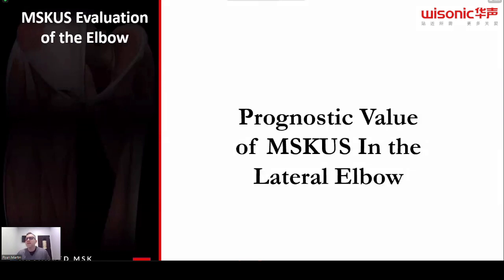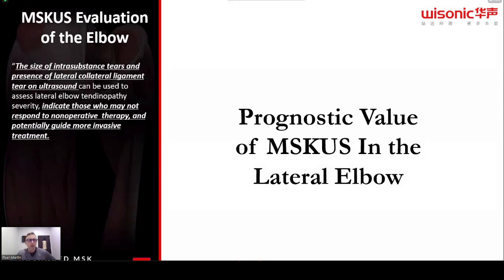What is the value of using MSK ultrasound in the lateral elbow? Well, if you look at these tears and these spaces, it can help you determine whether or not you can help that patient non-operatively, or with conservative physical therapy, or even with orthobiologic regenerative type medicines in a clinic.